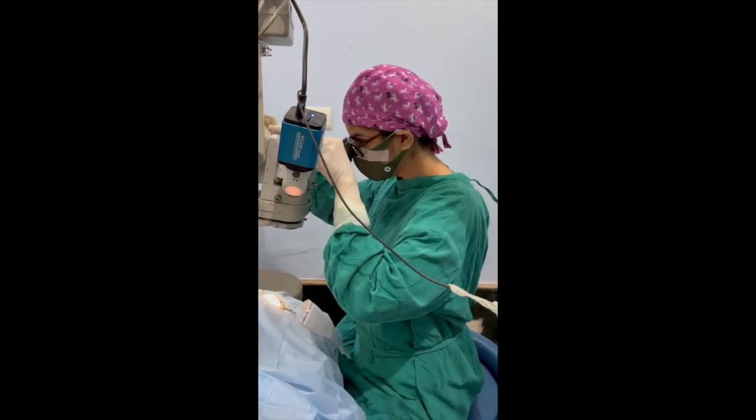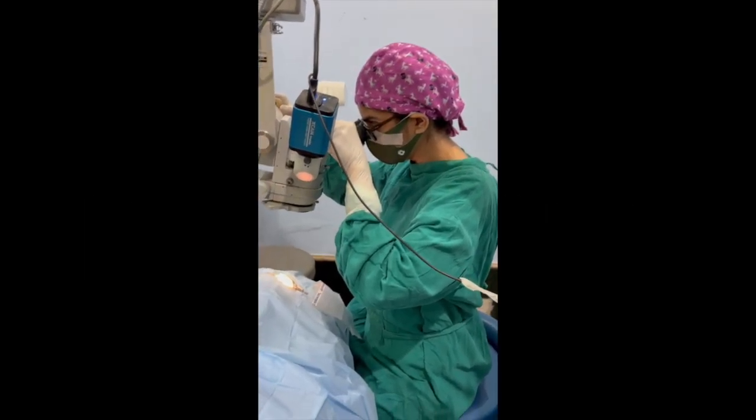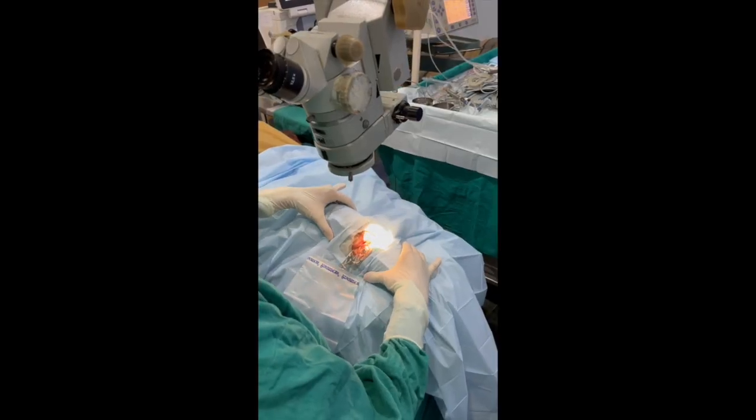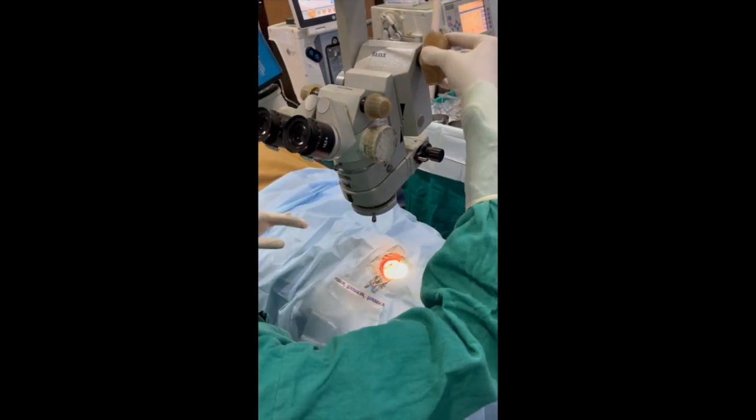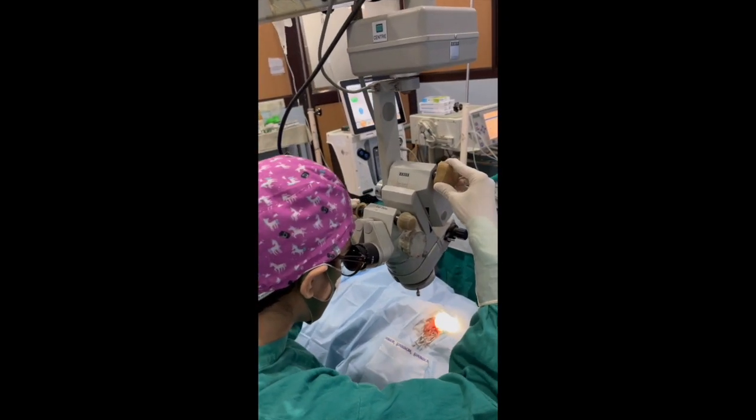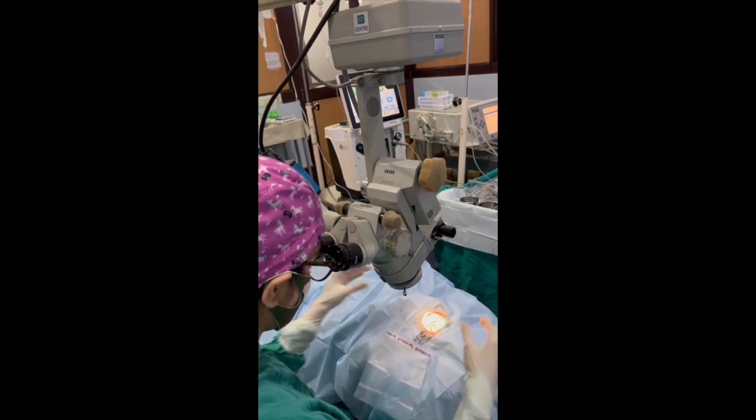At this point, it's very important to get comfortable with the basics of angle surgery. The surgeon needs to be positioned temporally in order to treat the nasal angle. The patient's head is tilted 35 to 45 degrees away from the surgeon, and the microscope is tilted 30 to 45 degrees towards the surgeon.